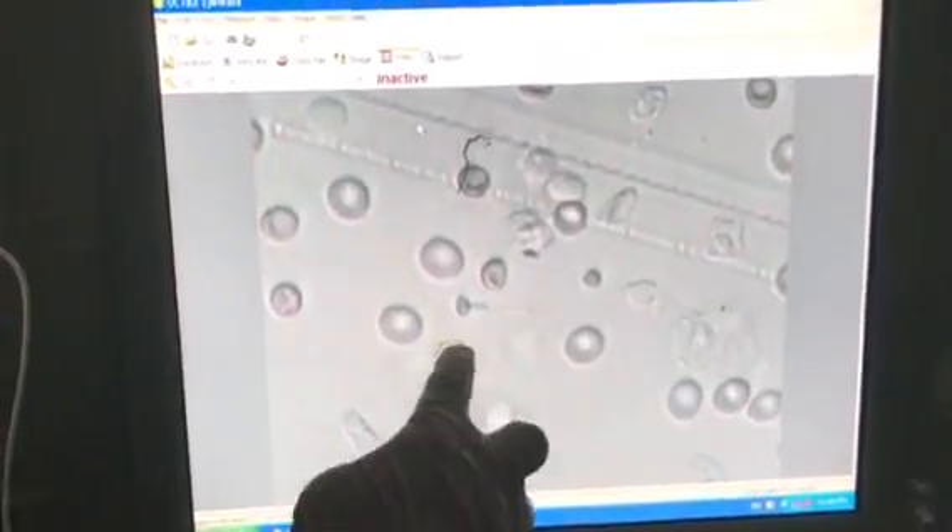Wow, now this immotile sperm is moving — actually this sperm is twitching. You can see the sperm is still immature; you can see the debris in the neck. This is a good morphology but it has to mature further. It's still a good sperm.